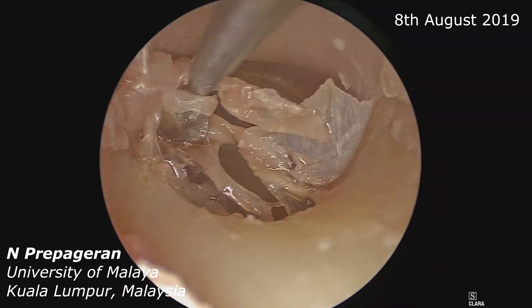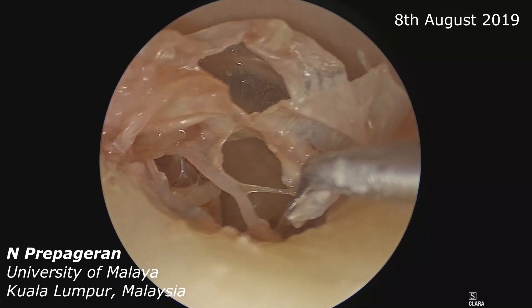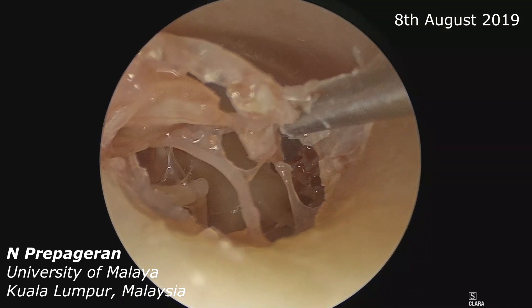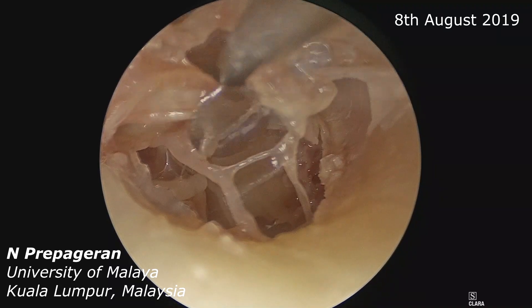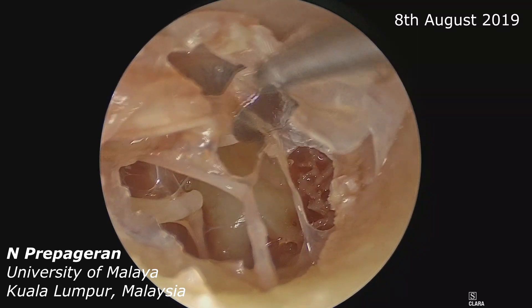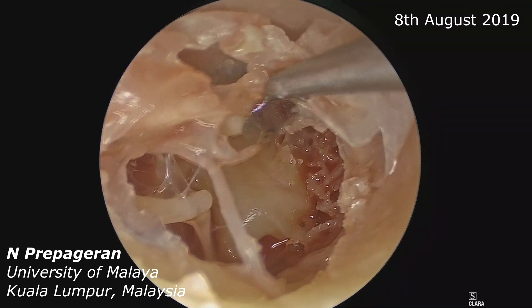Now we are in the middle ear space. You can see the structures lifting up the annulus as well. You can see the structures in the middle ear — the chorda tympani — and you can see the malleus and the incudomallear joint.